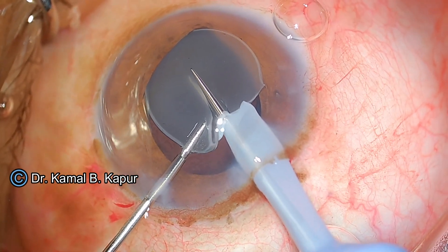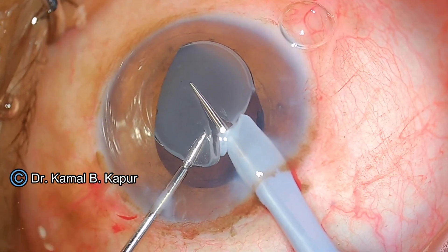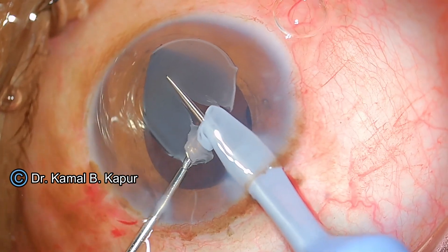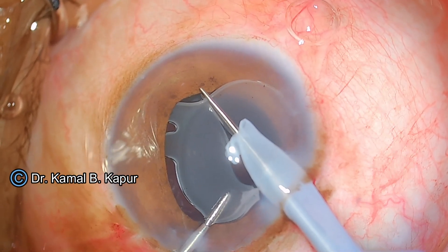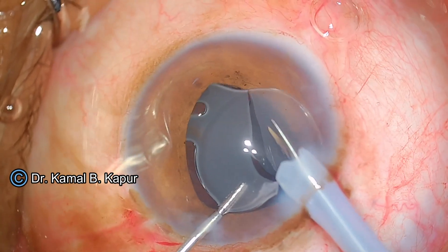At 60% power, you can notice the left hand is pulling the IOL towards the cutter while the cutter is only slightly being inserted into the eye. You can see the IOL is being cut — notice the left hand which is pulling the IOL towards the cutter. The cut is progressing.